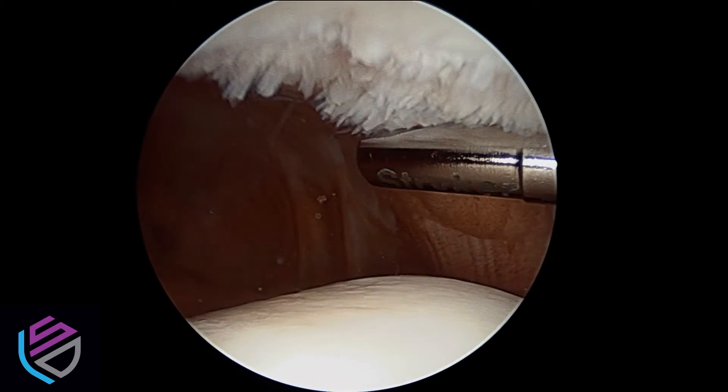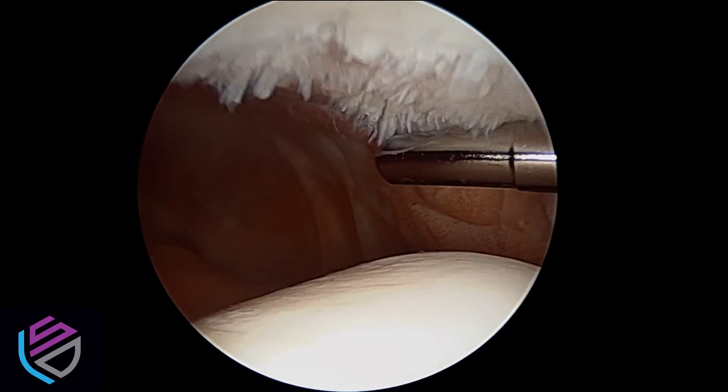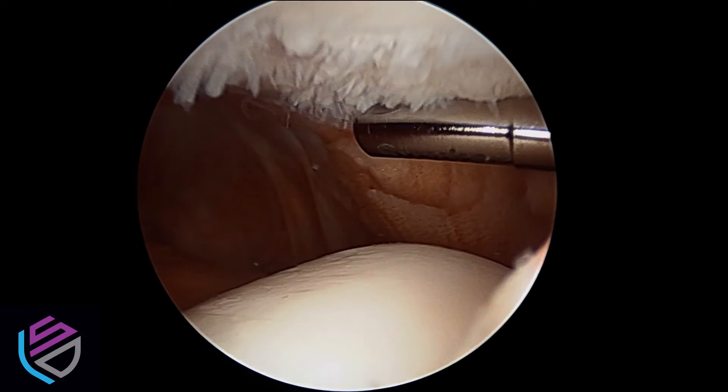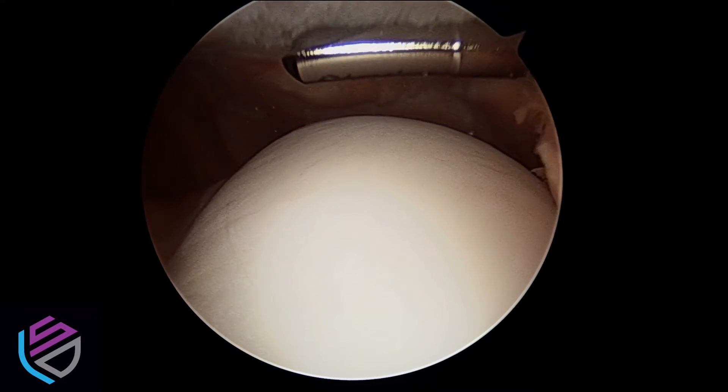Most people will experience crepitance, which is a crunching or grinding in the knee that can be heard and felt. It's important to note that removing the damaged cartilage may help your knee feel better, but it may not take away all of the noise.